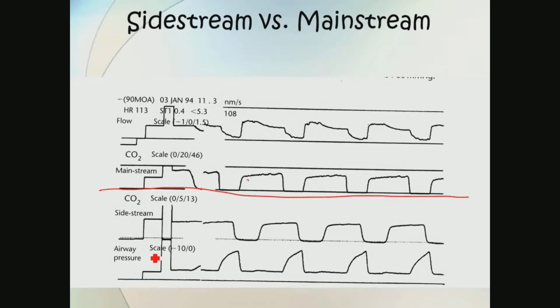This is sidestream. This is mainstream. So main here, side here. And this is where the breath actually starts. This is looking at actual breath origination. And what you notice is that as the breath starts, you end up seeing end-tidal CO2 starting also.